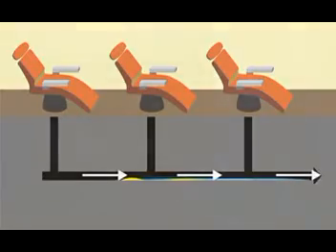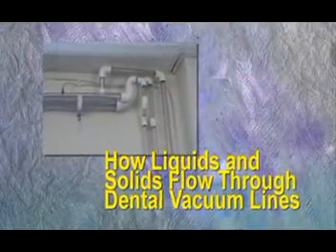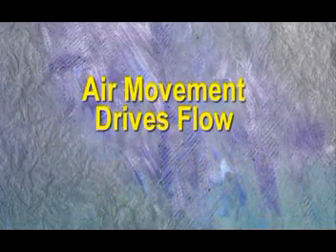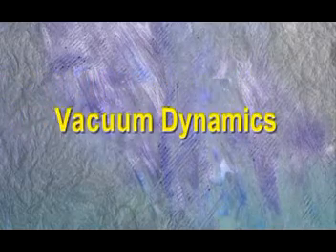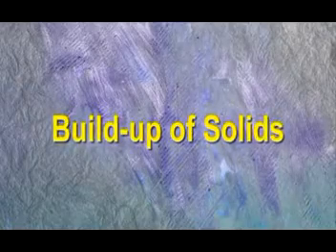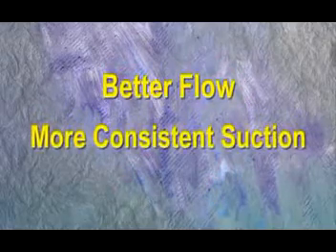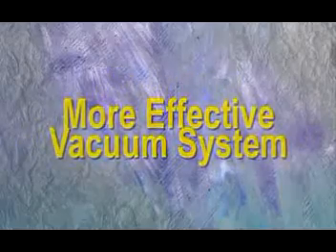You should now have a better understanding of how liquids and solids flow through dental vacuum lines. Since air movement is what drives flow in a dental vacuum system, an understanding of vacuum dynamics will help you prevent the buildup of solids, which can impede airflow through the line. More air movement translates into better flow, more consistent suction, and hopefully a more effective vacuum system.